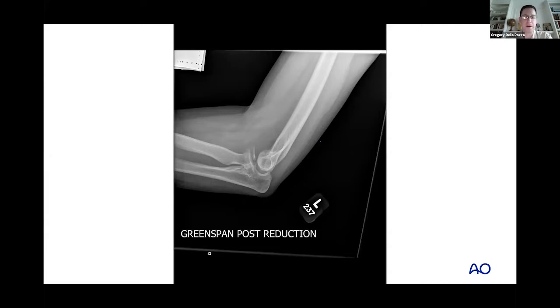So if you see, we did a repeat reduction attempt, and this looks much better. You will notice that I'm going to attempt again to pull up a spotlight here. You can see there's a fairly substantial piece of bone just underneath my spotlight. It's adjacent to the radial head, and the arc almost looks identical to the radial head that's adjacent to it. Okay, so this is a radial head fracture that you can see.